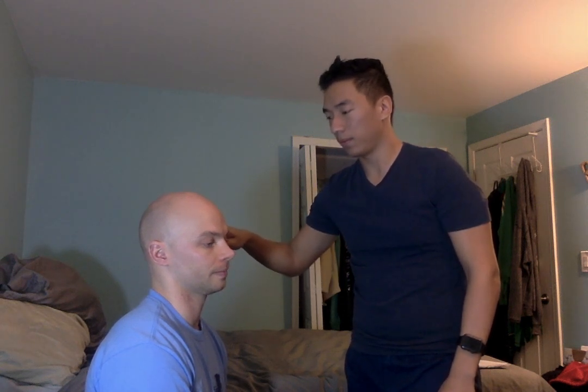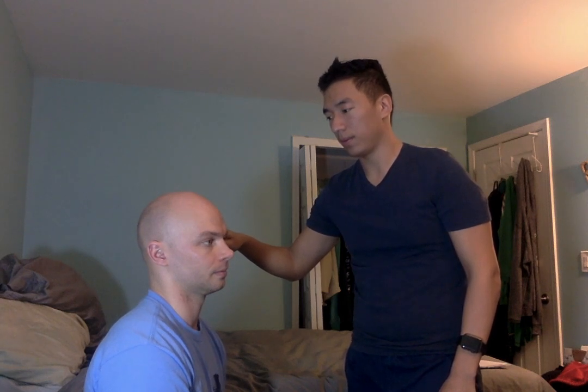Good. Now I'm going to test air and bone conduction. I'm going to strike my tuning fork and then place it on your mastoid process. You're going to tell me when you can no longer hear it, and then I'm going to move it to outside of your ear, and you're going to tell me again when you can no longer hear it. Okay. So first we'll do the left ear. No. No. Okay, good. We'll do the same with the other ear.